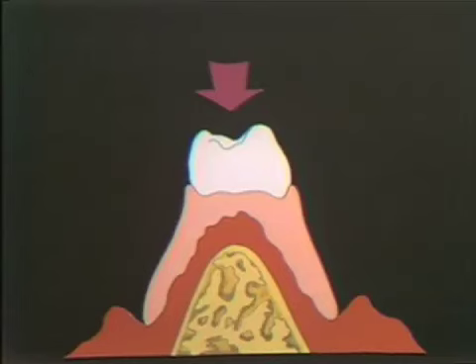Whereas if an unstable base is held in contact with the tissue, we could get ridge resorption. With the stable base, the tissue can support comfortably in a natural, contented position, because the static tissue, or the tissue at rest, created the impression. So the goal of this procedure is to capture the tissue at rest.